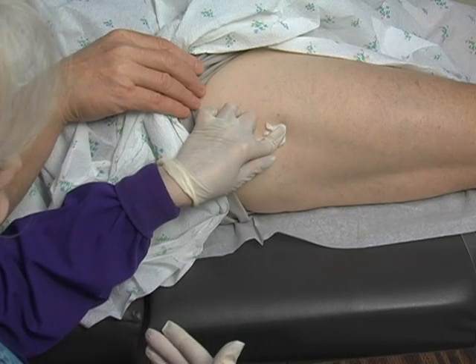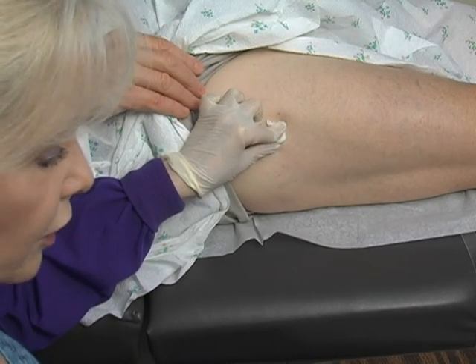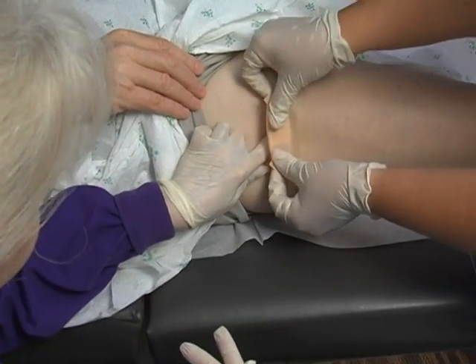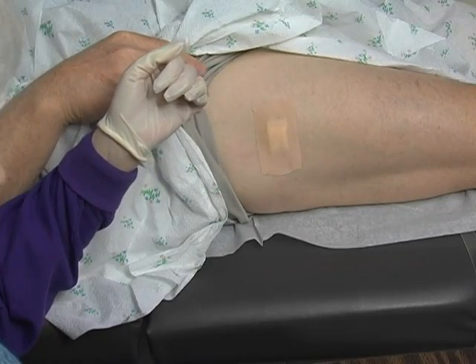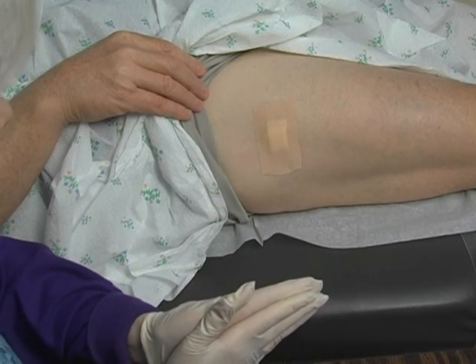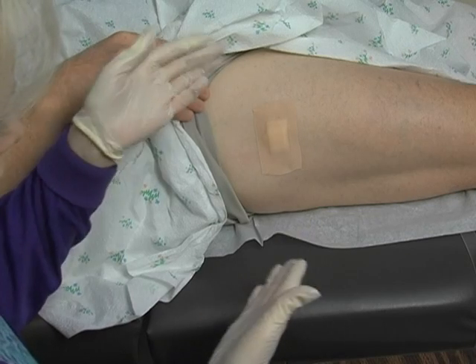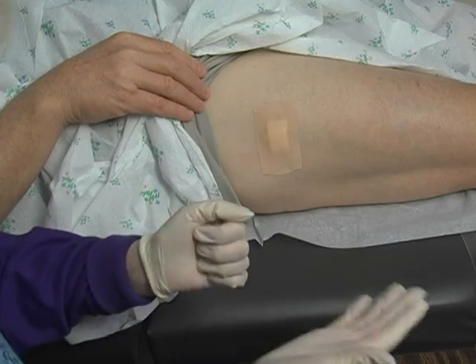One of the things I always ask my patients is whether they're on any type of blood thinners. Even aspirin can cause a little bit of excessive bleeding. There is no requirement that they need to be off those, but you might notice you'll need a little extra pressure after the specimen is taken. Your kits supply a little dot band-aid, but since there are no physical limitations after the specimen is taken, we like to use a pressure dressing — folding up a little two-by-two and applying a non-latex bandage occluded on all four sides. This band-aid stays on for the next 24 hours, so we tend not to have any oozing through the bandages or onto their clothes.